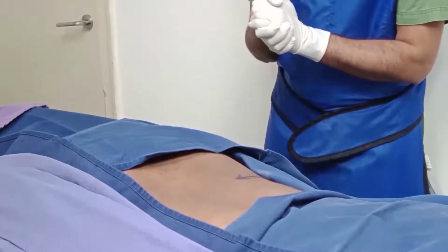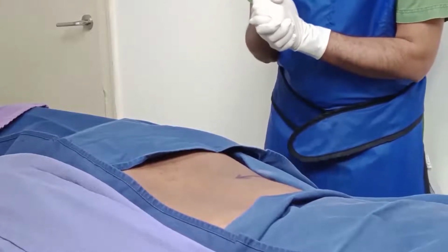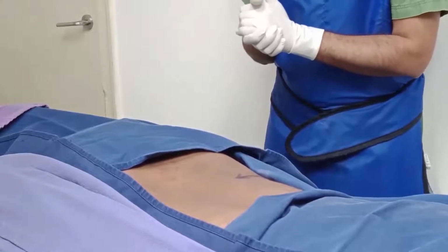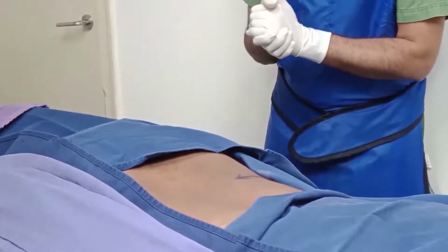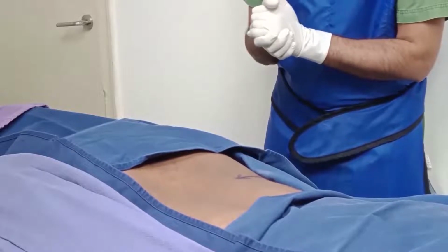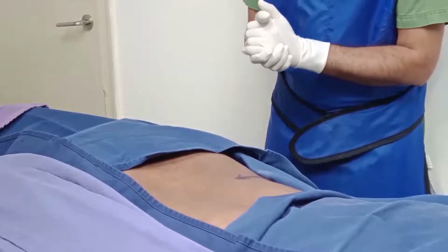Surgical site infection measures undertaken, patient warming: yes, the patient is warm. Hair removal: not required for this procedure. Glycemia control: the patient is not diabetic. And it is available online if required.